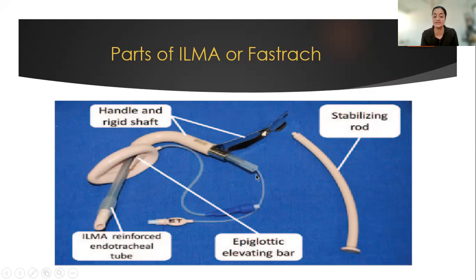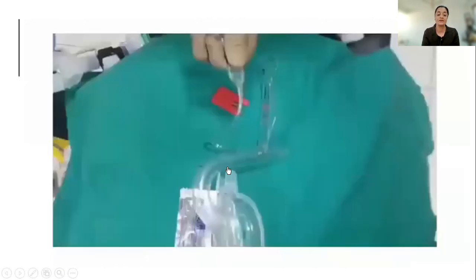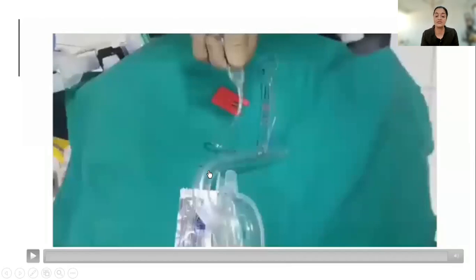There is also a universal connector which comes along with the set, which fits at the proximal end of the endotracheal tube to connect it to the circuit. Now coming to the video — I'll be showing the disposable fast track intubating LMA set.